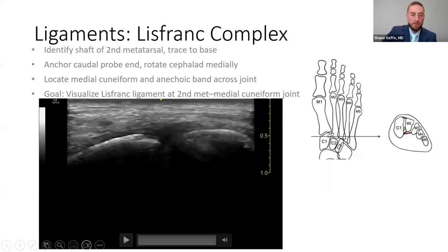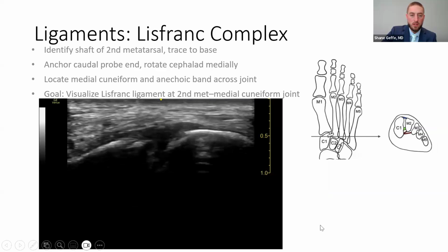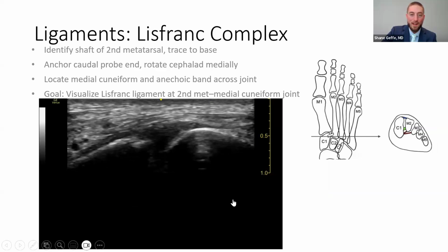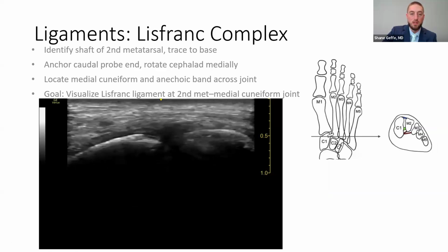Here's another video of me tracing it back. If I were to do this again, I would show the tracing going from the second to the intermediate and then finally to the medial, because I think it's easier to show than to tell.